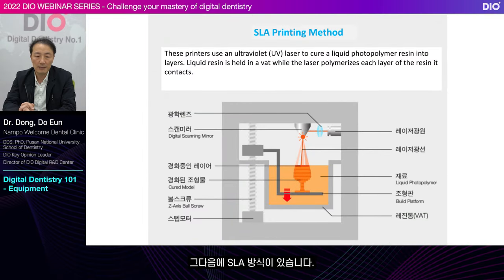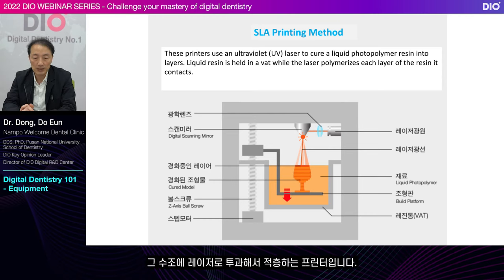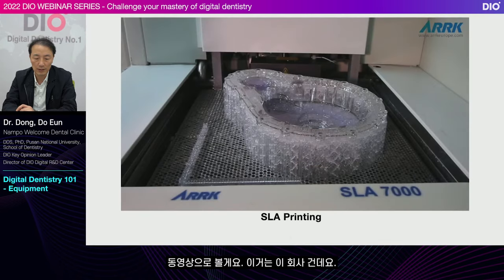Next is the SLA method. You see a bath in the resin container. This printer creates layers by penetrating the bath with a laser. This one is difficult to understand by looking at a static photo. Here is a video. This is from this company. Let's take a look.